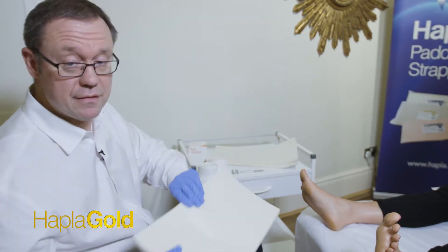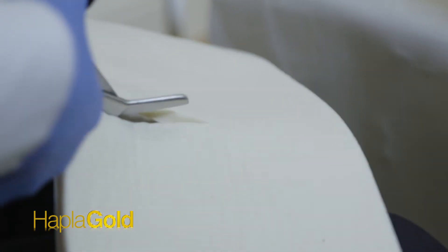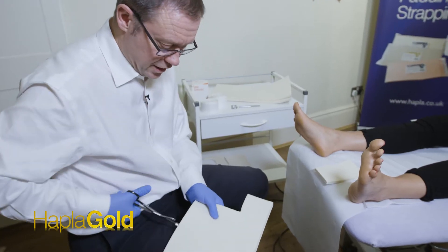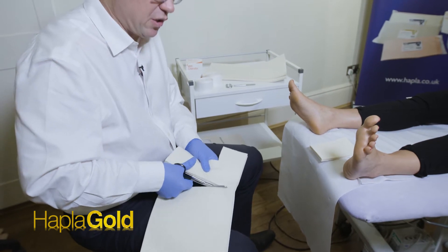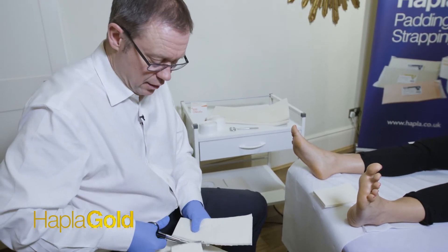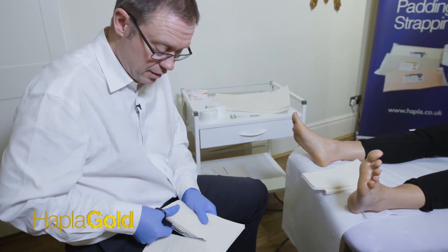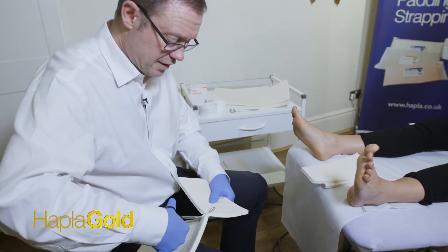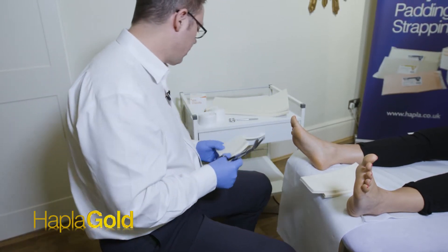We take some 10mm felt and cut out the three pieces that comprise this 3D system. The first piece will be effectively a valgus filler pad. The second piece will be a plantar slab in which there will be an aperture to offload the ulcerative site. And the final piece will be a plantar cover with an aperture sighted over the first aperture on the plantar slab, to give absolute offloading to the area under foot.